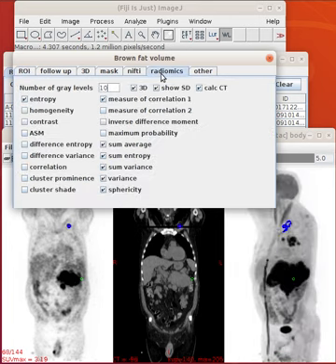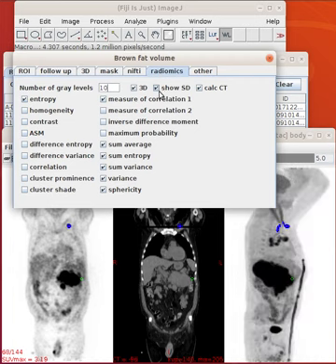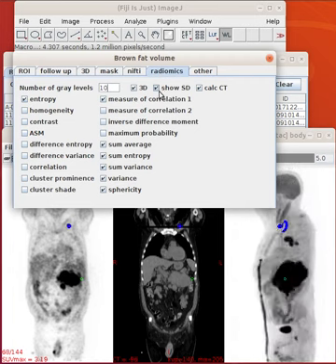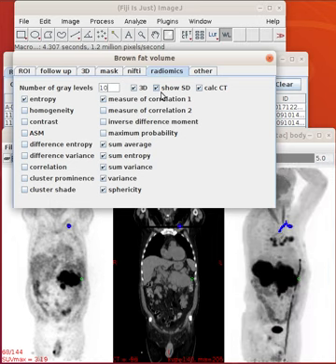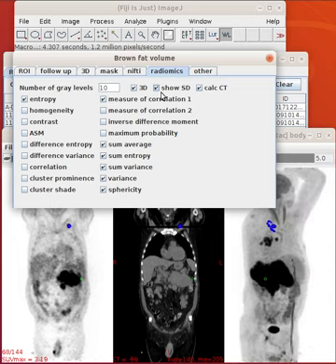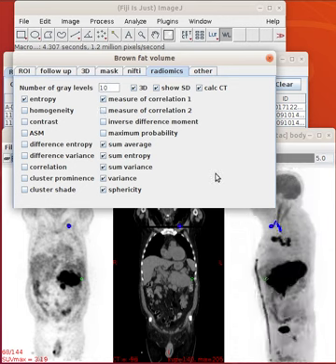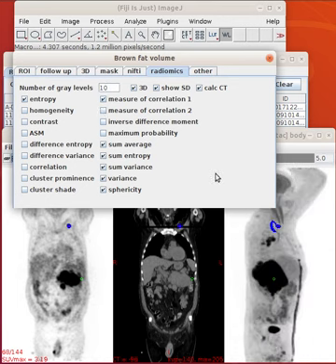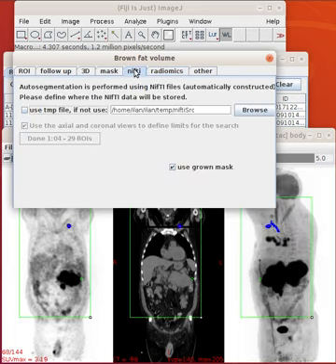That makes no difference for the total metabolic tumor volume, because the TV is the sum of all regions. So whether the tumors are spread over 10 regions or all in one region, it makes no difference. But for these radiomics, you want the region to cover the entire organ.